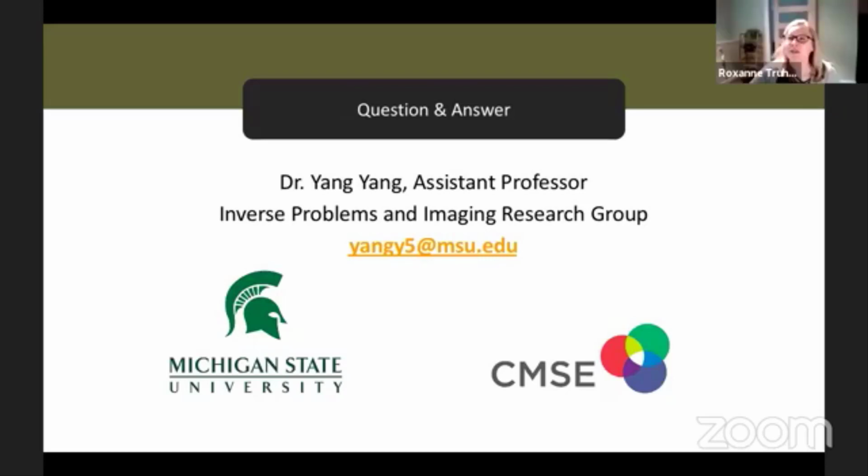Thank you, Dr. Yang. That was really interesting. I've never seen the three-dimensional teeth before. I would imagine, if you need braces or jaw reconstruction, it would really help the dentist to see a three-dimensional model for your jaw. Yes, you can see the model from different angles. You can drag it, you can rotate it, and you can look at every detail of that. Compared to the 2D, where everything is stacked over and you just see one image.